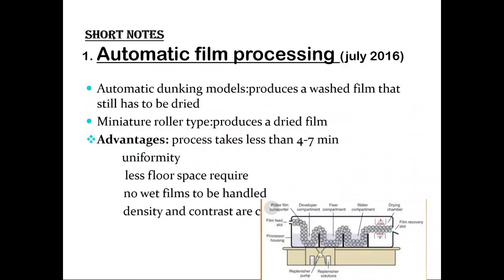There's this automatic film processor wherein you have a film entry. You just have to place a film within it, and then it goes from one solution to the next, that is from developing solution to the fixing solution. Then it goes for the water wash, and the rollers that are placed help to move the film from one solution over to the other.